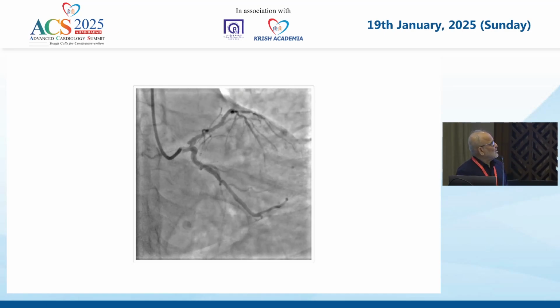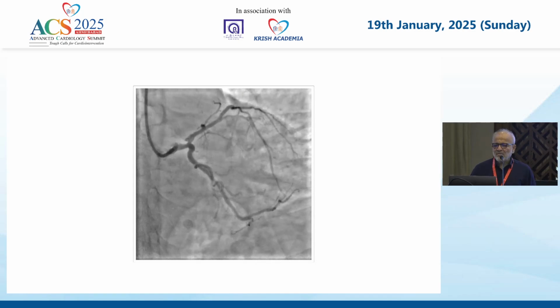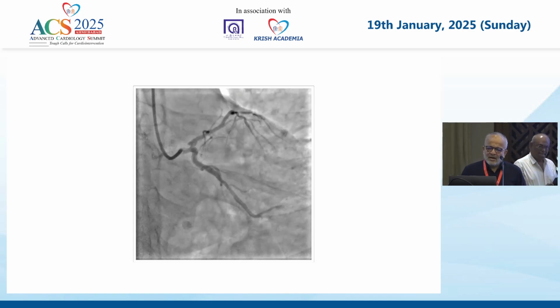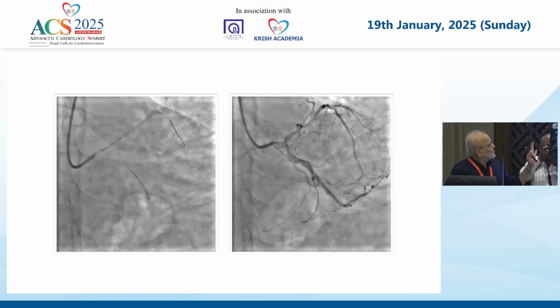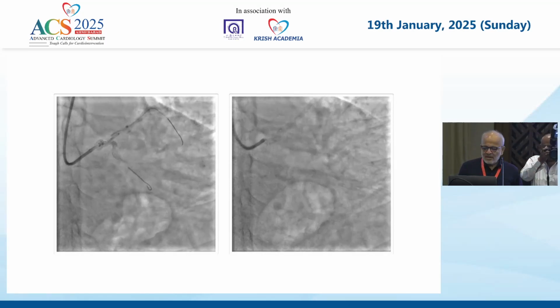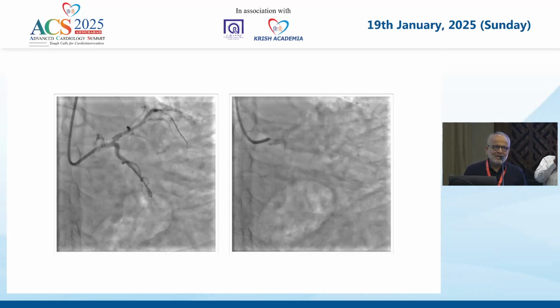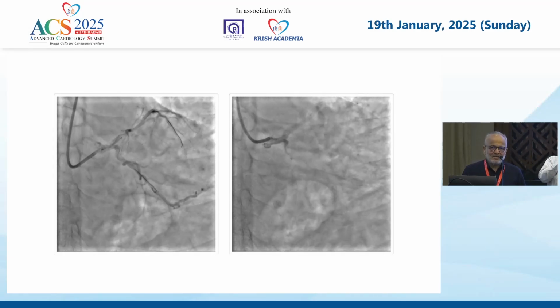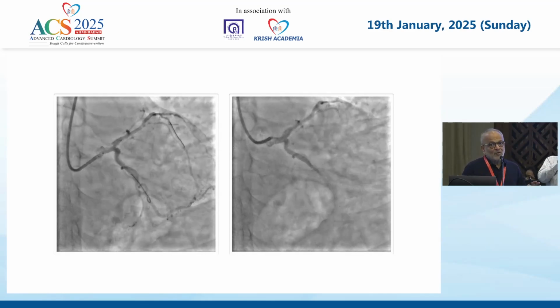The stent is in the proximal LAD, and it looks very awkward. There is some ectasia there. And we worked on it. It looks very simple at this point of time. We did left main to LAD and then kissing balloon and a perfect result. But then we spent half an hour perspiring and thinking what is going wrong.